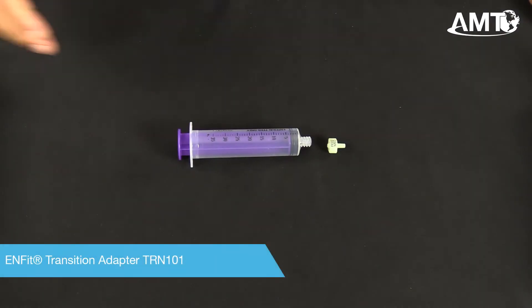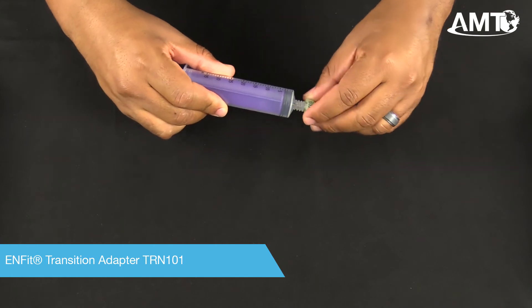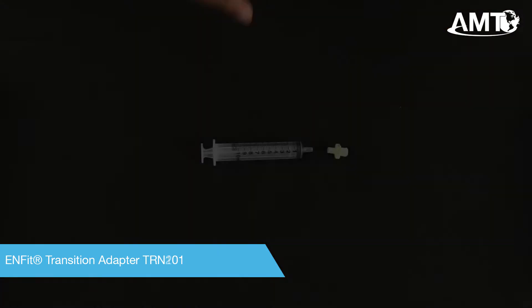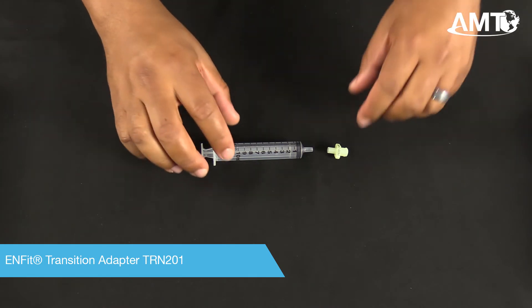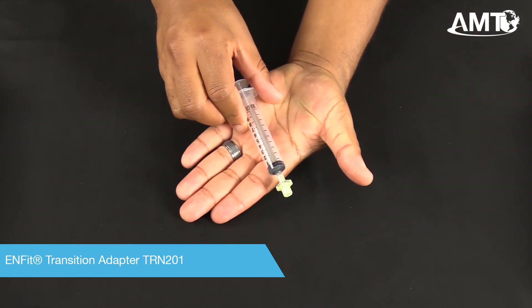If you have an InFit syringe and need to transition it to a slip-tip syringe, simply attach TRN-101. If you have a slip-tip syringe and need to transition it to an InFit syringe, simply attach TRN-201.